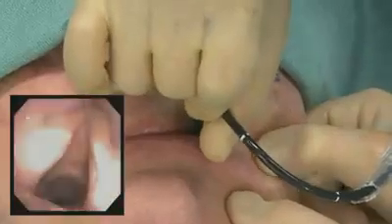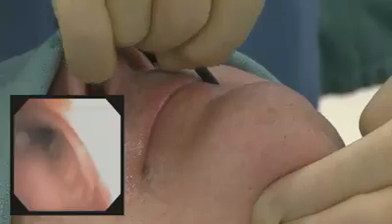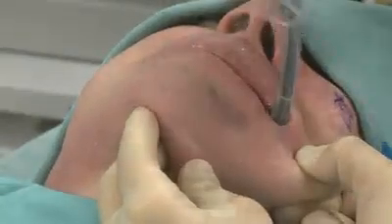The orientation of the fibroscope is different from the midline approach. However, the anatomic structures will appear the same. When the glottic opening is visualized, advance the scope through the vocal cords to the trachea. Advance the tube steadily to enter the trachea using a slight twisting motion if hang-up is encountered.